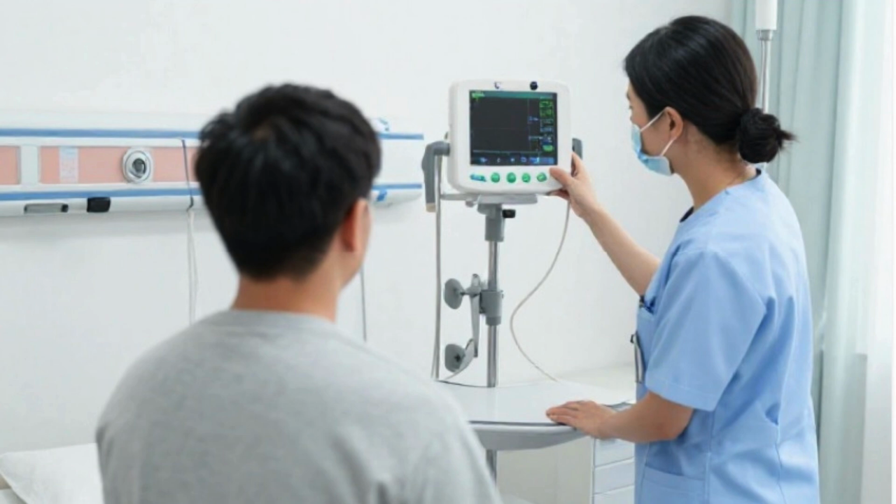7. What role do patient cables play in the monitoring system? A. They amplify signals. B. They record patient history. C. They transmit signals to the monitoring unit. D. They control alarm limits. 8. What happens to the physiological signals inside the monitoring unit? A. They are deleted after display. B. They are amplified and processed. C. They are converted into images. D. They are stored without modification.